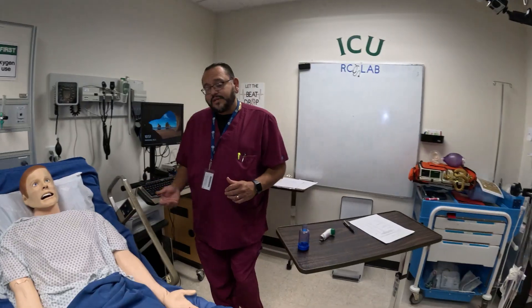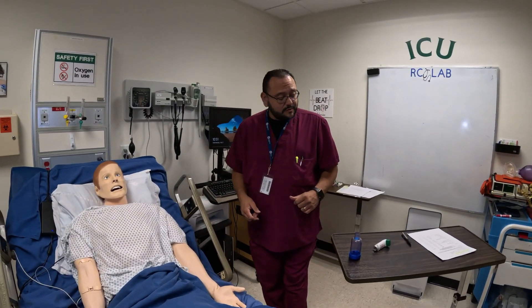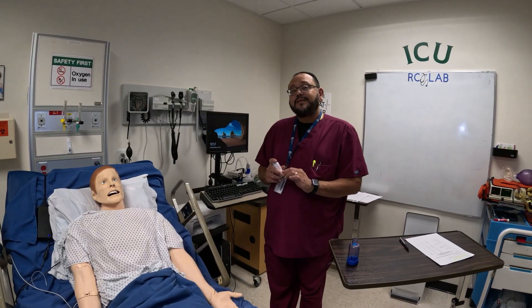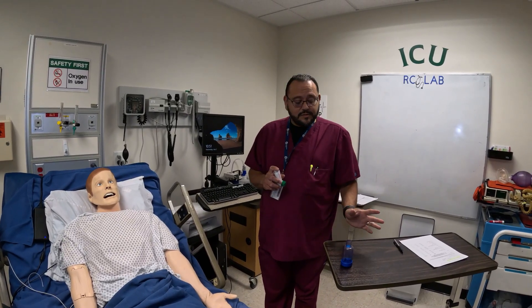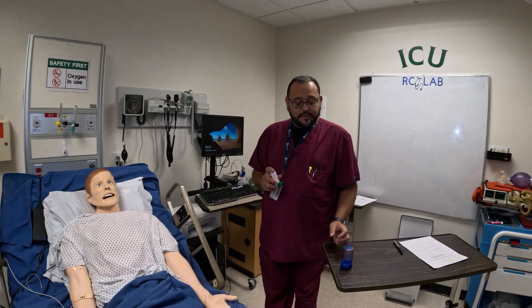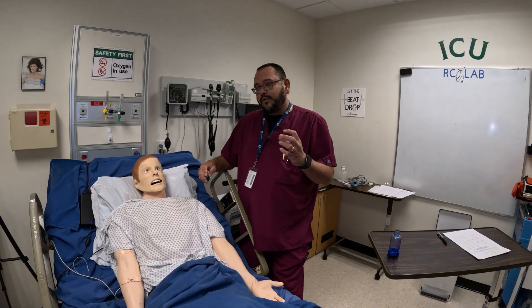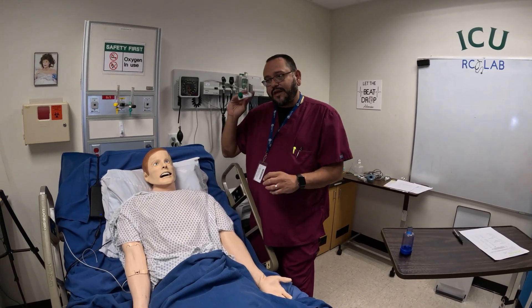We're going to get another set of vitals and make sure Mr. Smith is doing okay. The competency does mention doing it without the spacer, but I recommend always using the spacer from kid to adult — it's just a better treatment. More of the medication gets into the lungs; you get more going to the back of the mouth without it.